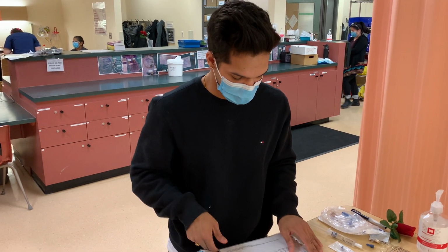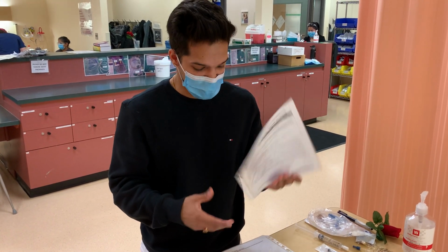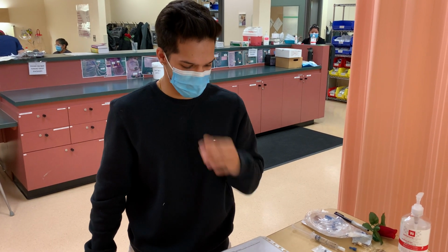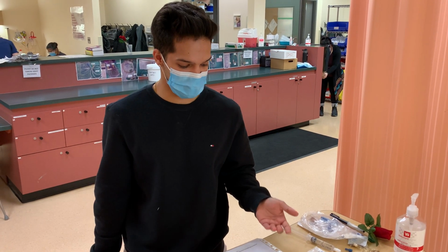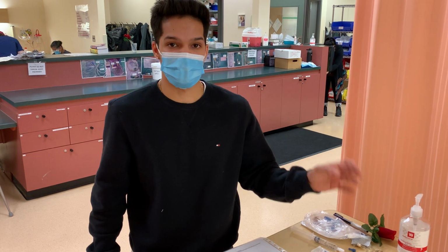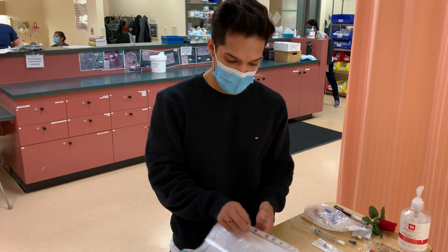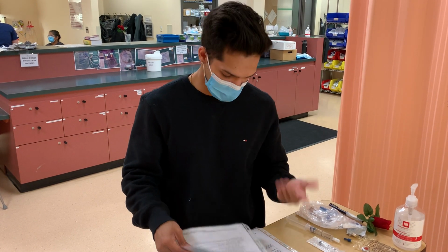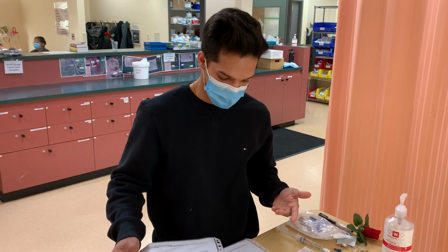Okay, so now that I have looked at the compatibility and the final concentration. Actually, one thing I did not mention was the final concentration within the bag after I dilute it. It would be 0.99 units per ml, since I would have 100 mLs in the bag of normal saline, and then add 1 ml of medication to that, which will be 101 mLs. So the final concentration will be 0.99 units per ml.